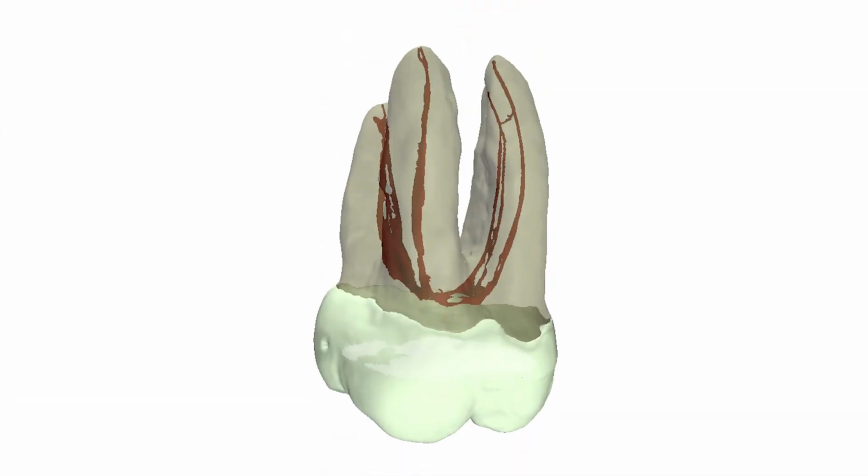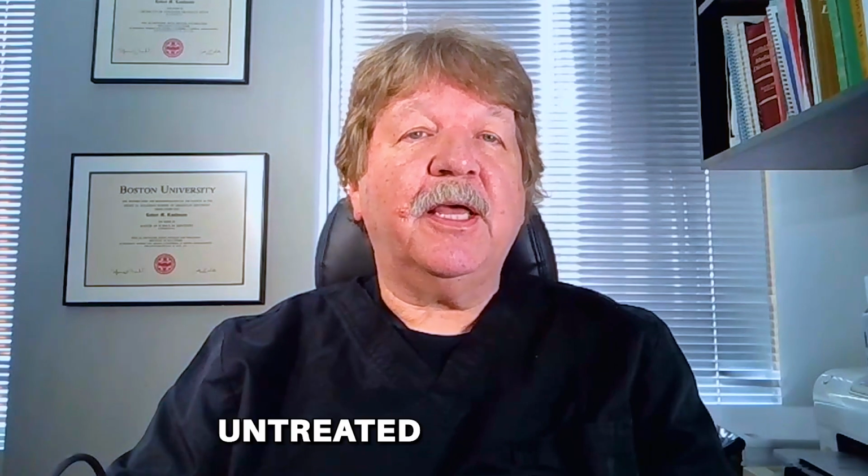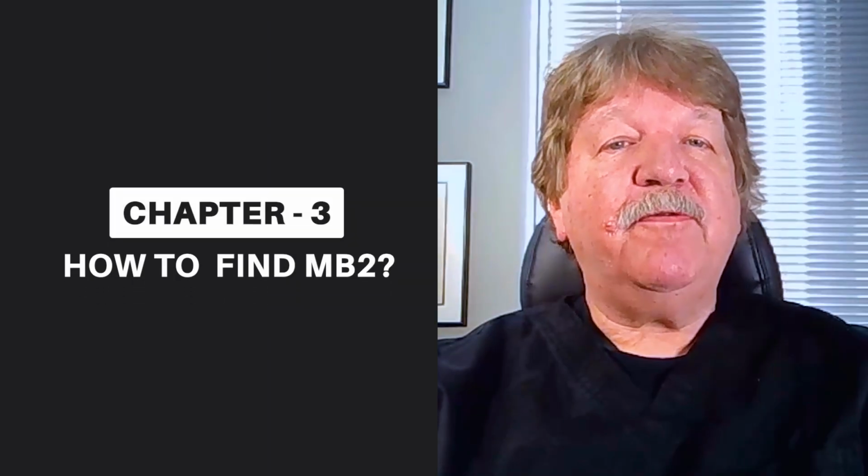In other cases where MB2 is a completely separate canal and where the pulp has become necrotic with associated periapical radiolucent findings and symptoms, you may not be so lucky. Endodontists frequently have to retreat cases like this and very often find untreated MB2 canals. So, how do we find MB2?